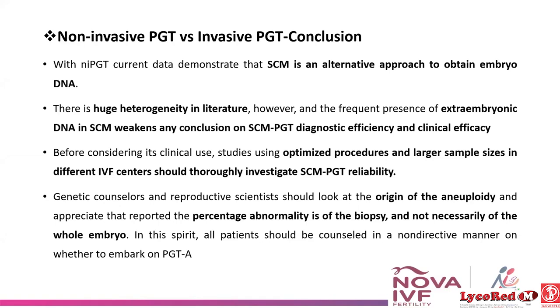But the problem is the huge heterogeneity in the literature, and the frequent presence of extra-embryonic DNA in spent culture media weakens any conclusion on spent culture media PGT diagnostic efficiency and clinical efficacy. Besides, before considering clinical use, procedures should be optimized and larger sample sizes in different IVF centers should thoroughly investigate spent culture media PGT reliability.